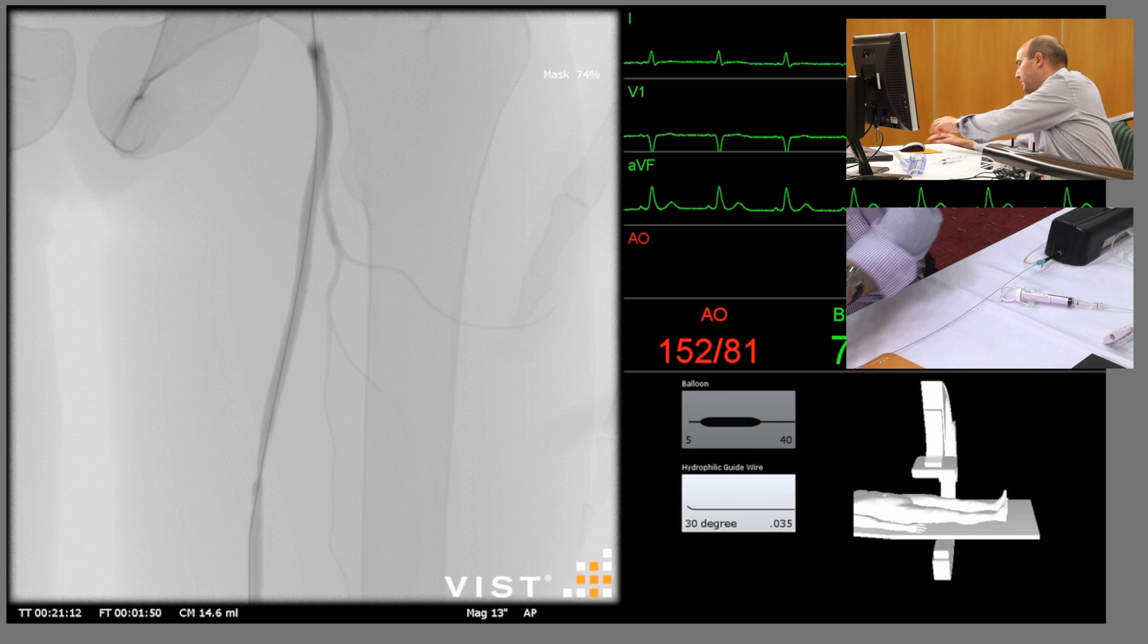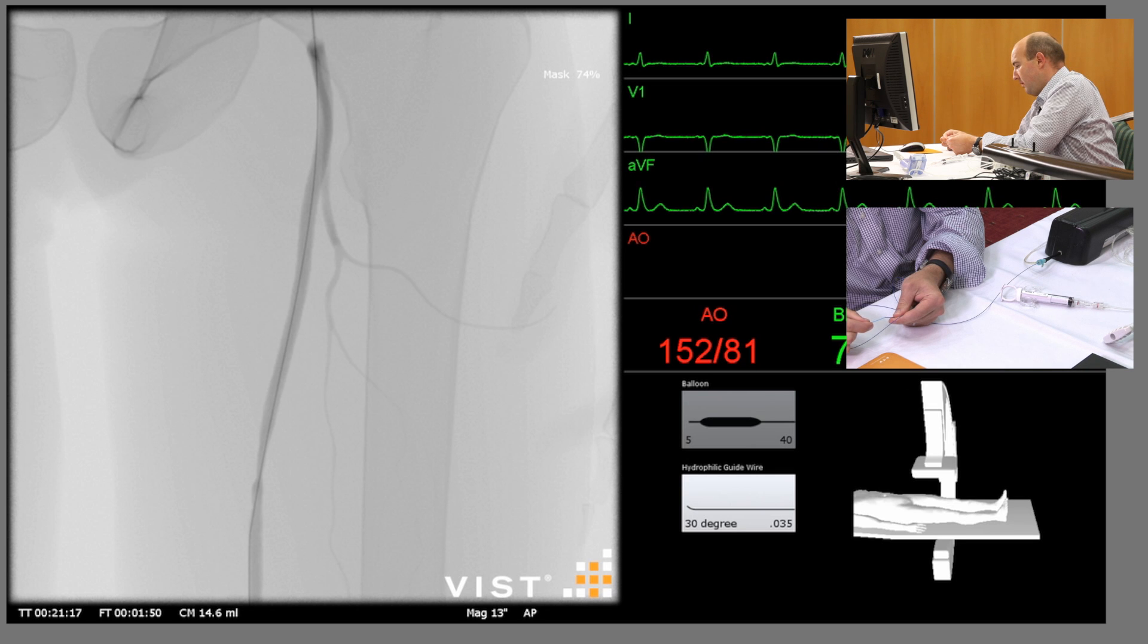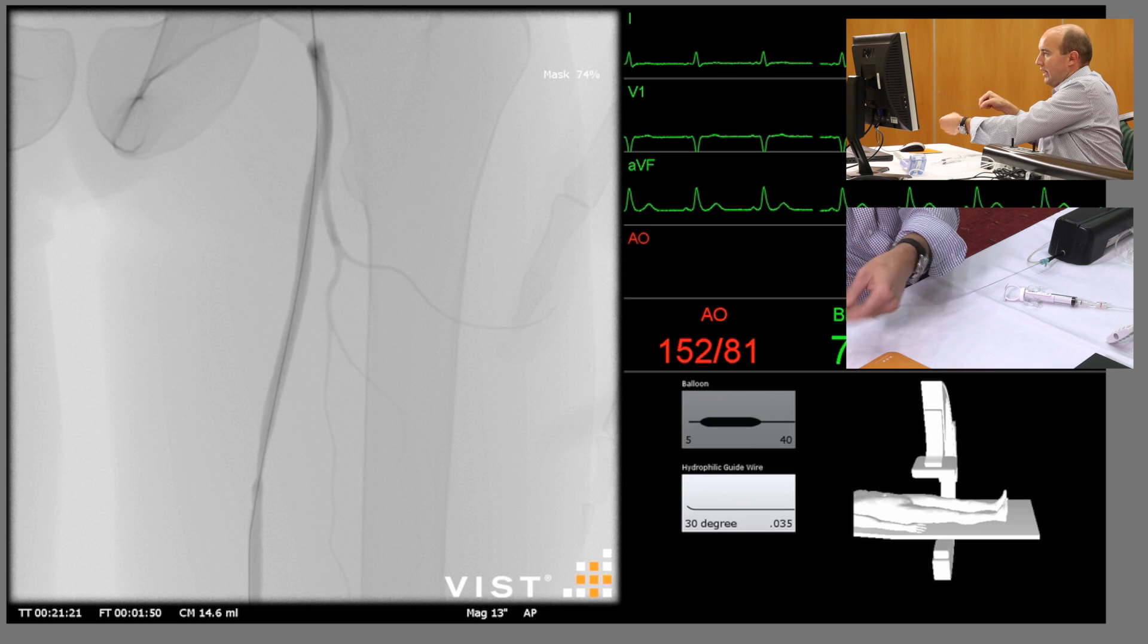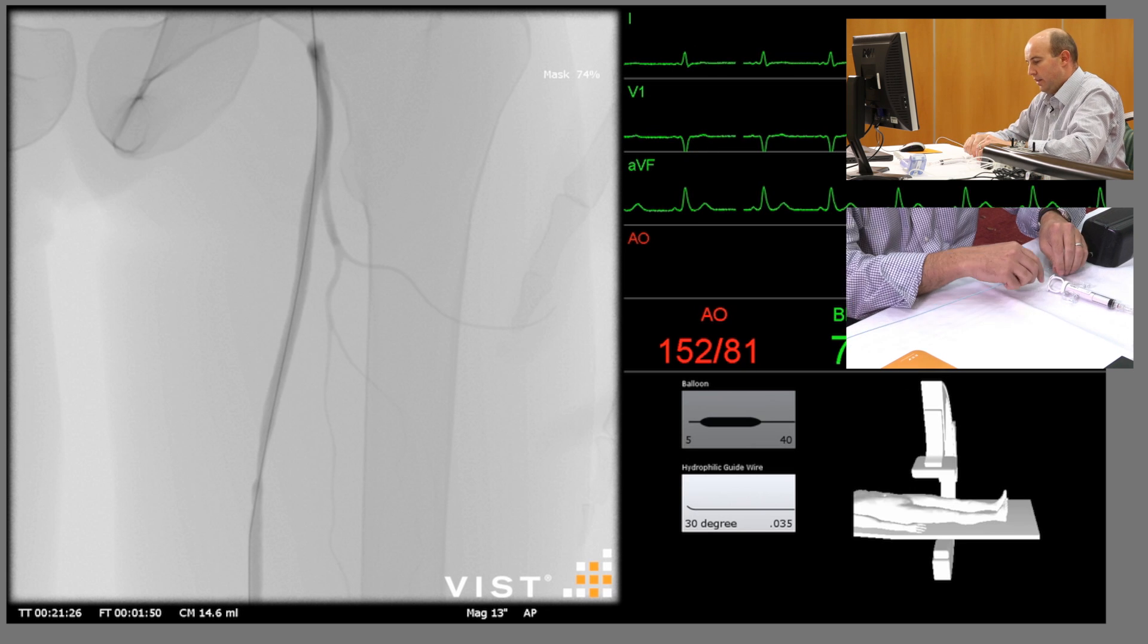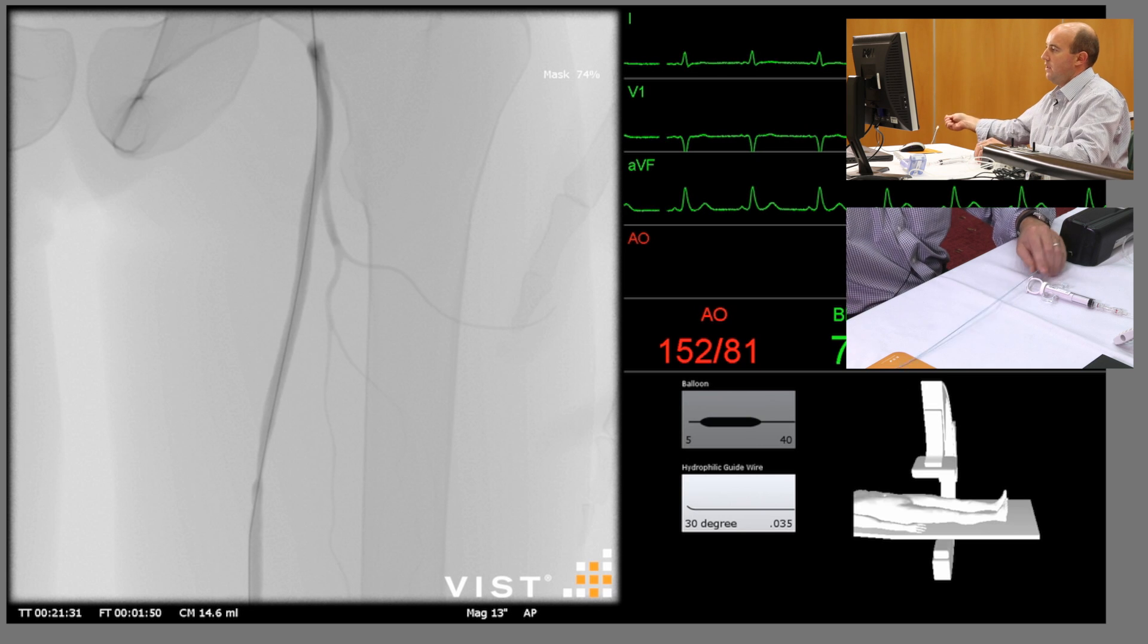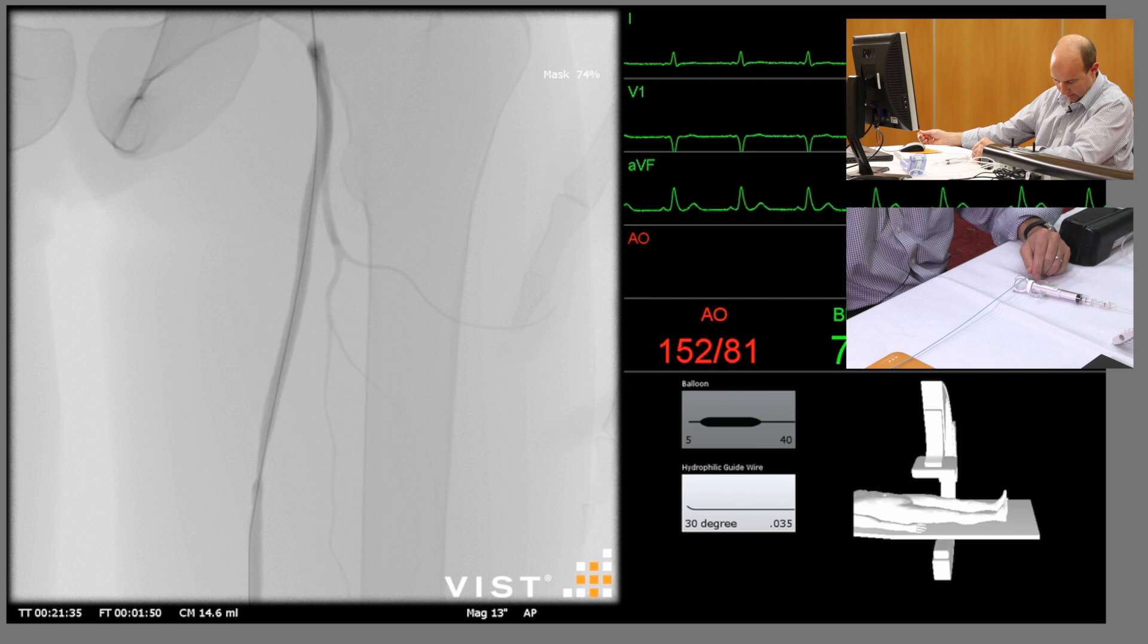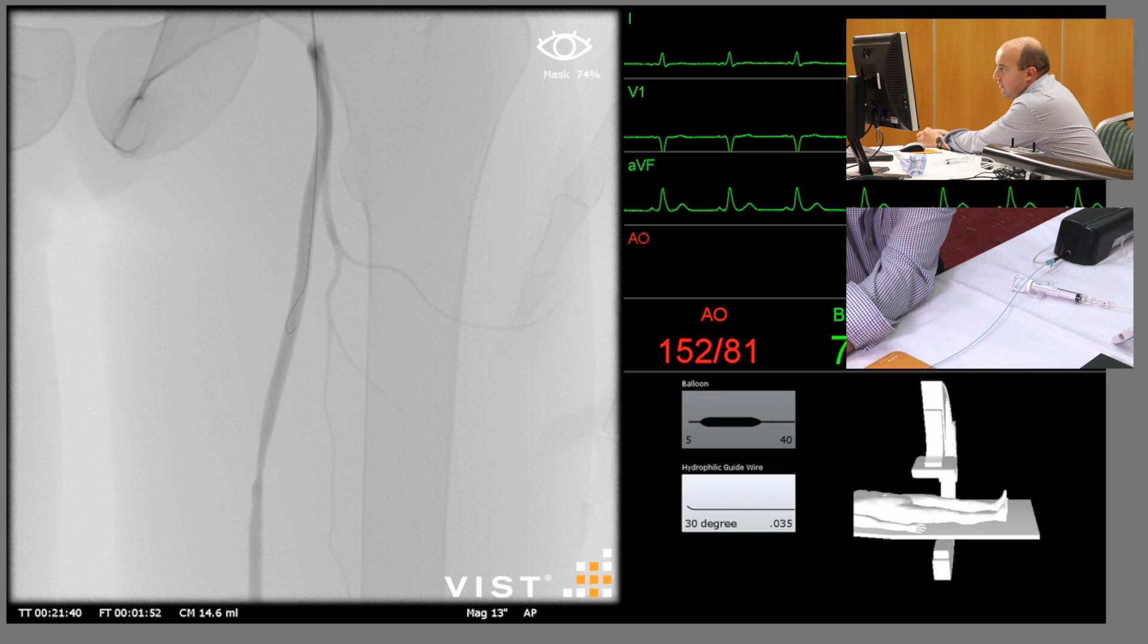And again, as described for the wire, you often have to put the catheter in a fair way before the actual system will recognize the device as a balloon. Let's come back a touch. It's not ideal.